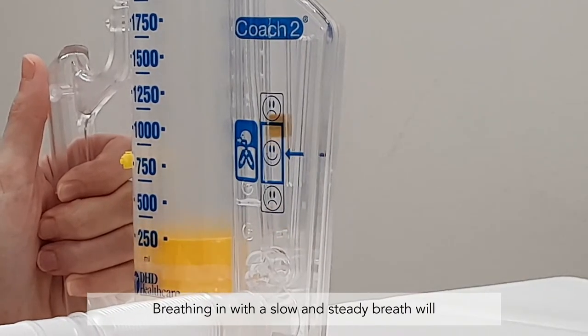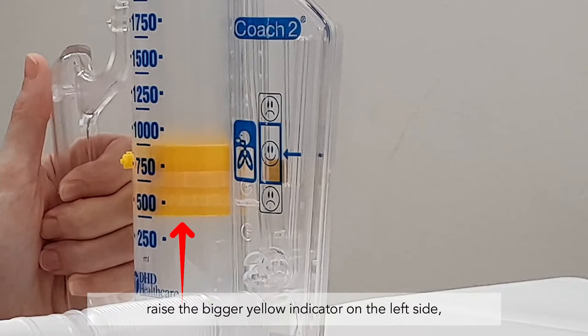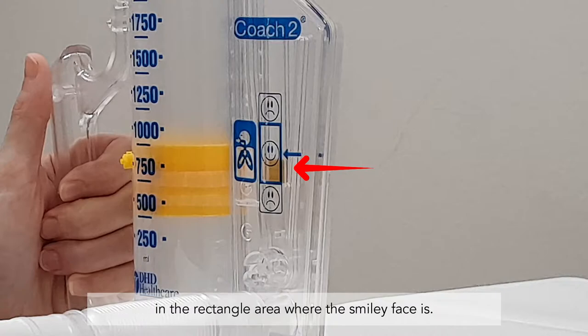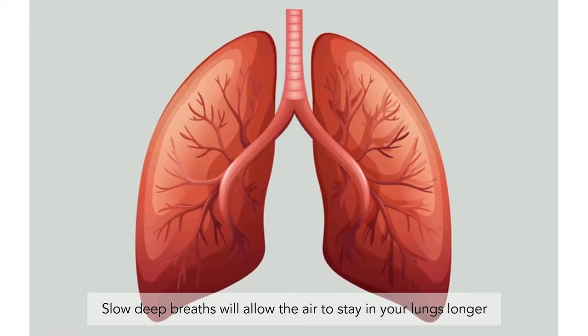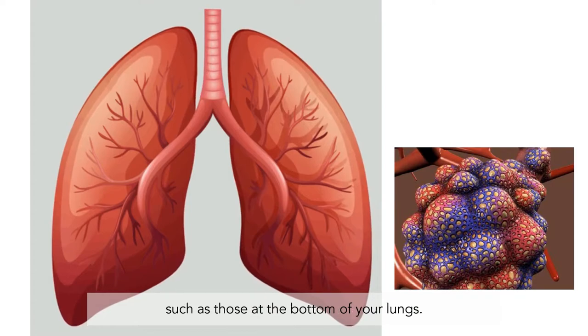Breathing in with a slow and steady breath will raise the bigger yellow indicator on the left side, and the smaller yellow indicator on the right side will be balanced in the rectangle area where the smiley face is. Slow deep breaths will allow the air to stay in your lungs longer and fill the airway pockets that are not as well inflated, such as those at the bottom of your lungs.